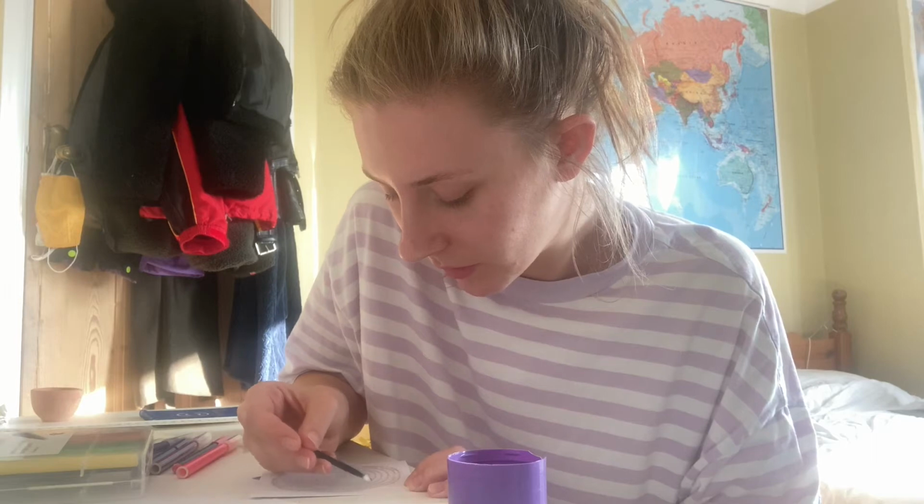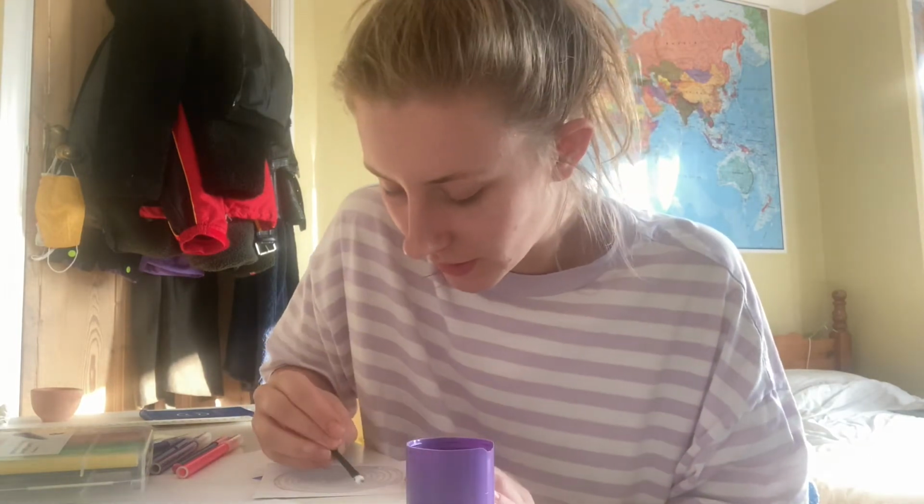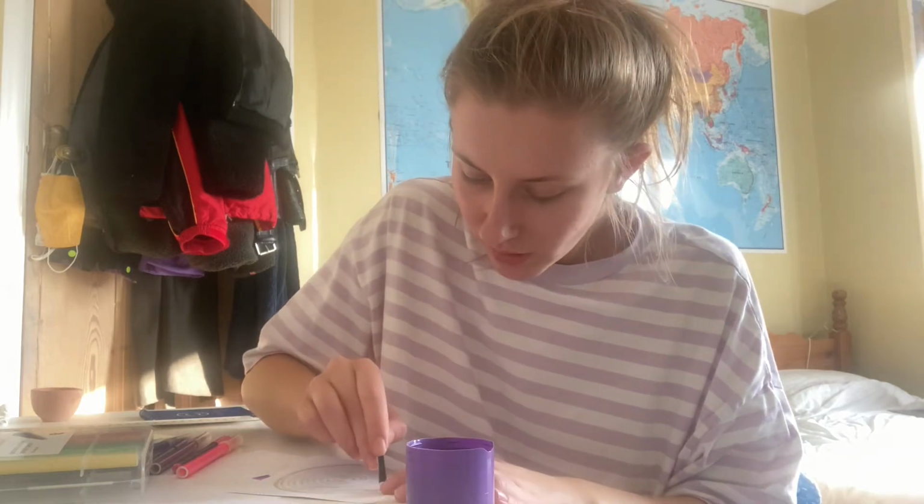This just covers it in that film of PVA, which will hopefully make sure it stays secure for a long time. Mine is still going strong after a good few months of wear, and I can see as I paint over this, some of the threads are moving out of place, which obviously means that it wasn't fully stuck. So it's a good thing that I'm doing this just to seal it, and then you can do any adjustments to the shape that you maybe need to do before it all dries down, because once it's dried down we won't be able to budge.